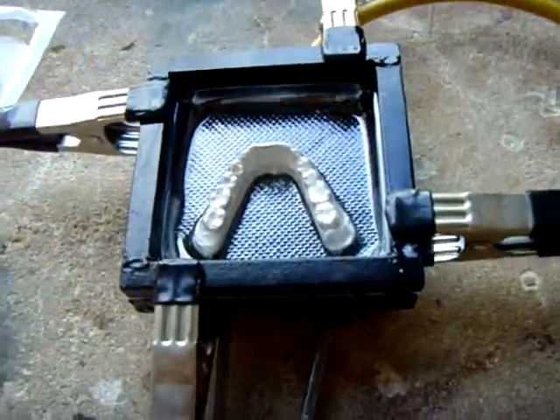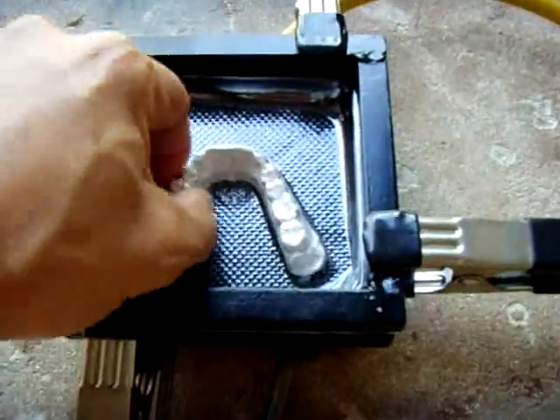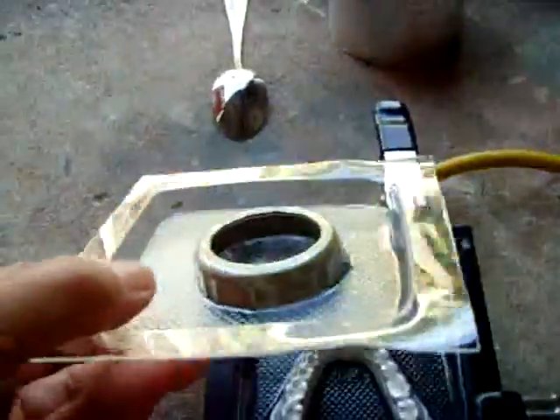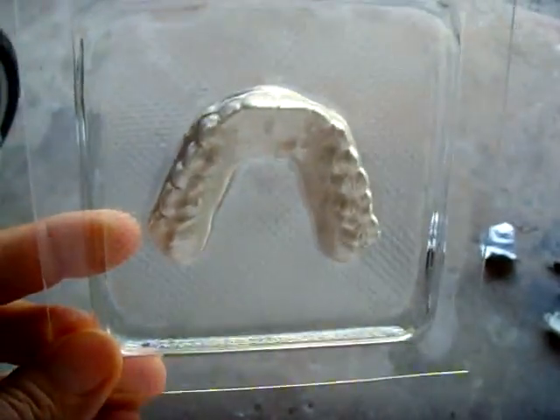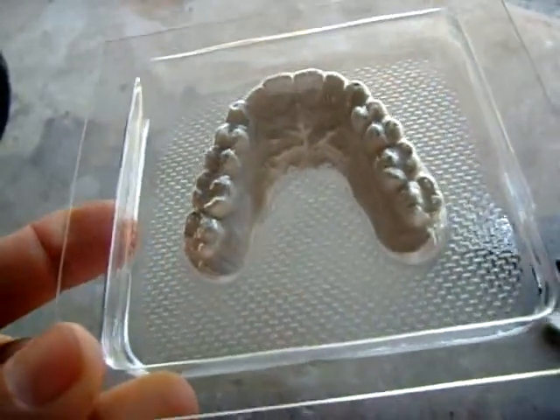This vacuum forming plate comes in extremely handy for a lot of different purposes besides just making retainers — you can pretty much form anything you want, like a quality set of fangs.